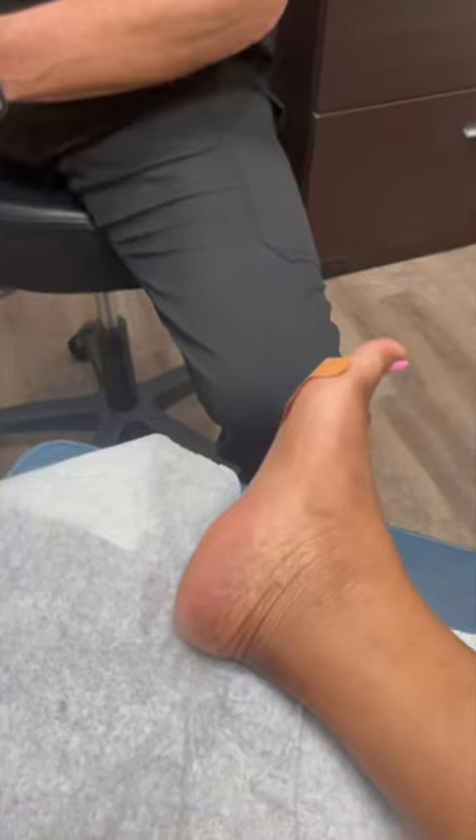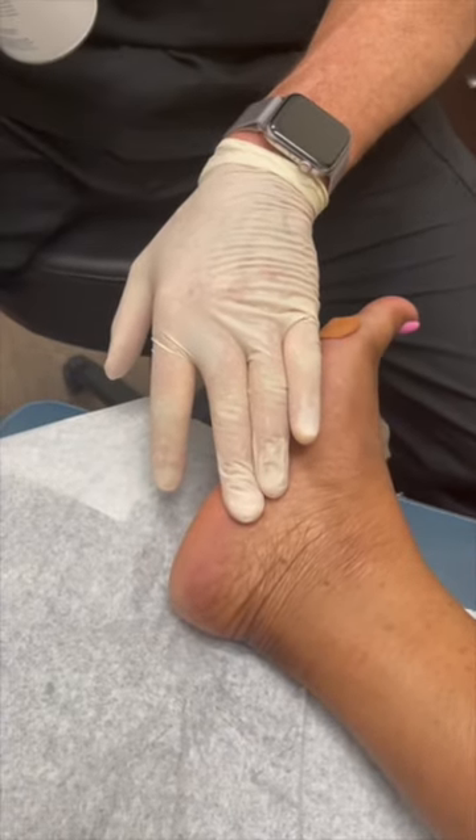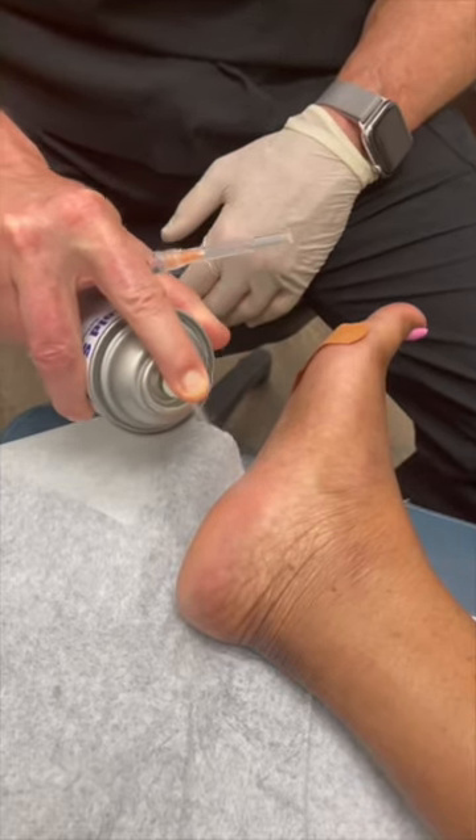It's pretty simple — we don't go through the bottom of the heel anymore. If you want to go up close here on the heel, I get it ready with a little bit of alcohol swab, which I already did, and with a little bit of cold spray, it frees up this little area here.